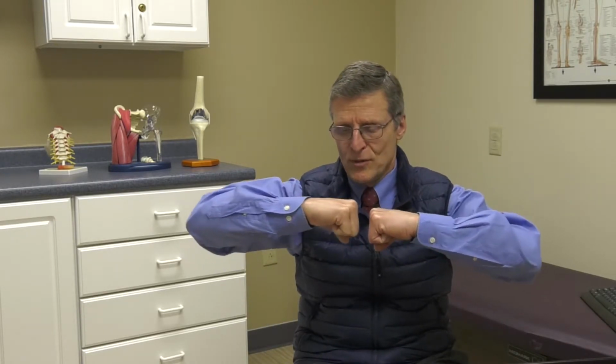The computer allows us on the femoral planning screen to define the exact parameters that are necessary in terms of femoral position, both distally and proximally, anterior and posteriorly, and rotationally. And if you really think about it, there are 6 degrees of freedom for each of the components of the knee. And the computer helps to be sure that we are planning our cuts to be in the appropriate position and posture for each of the components.